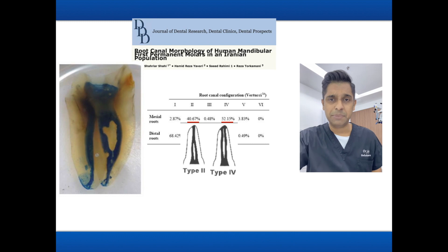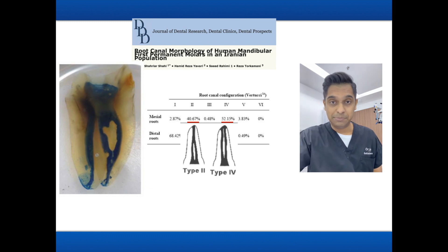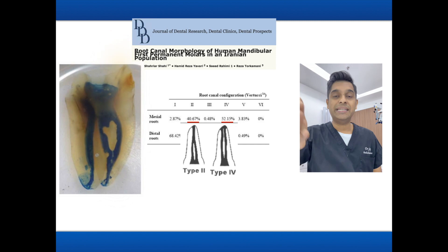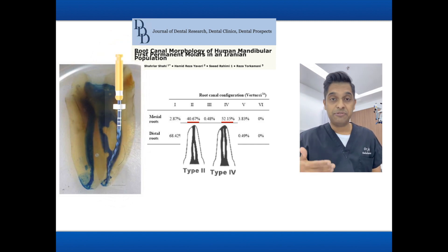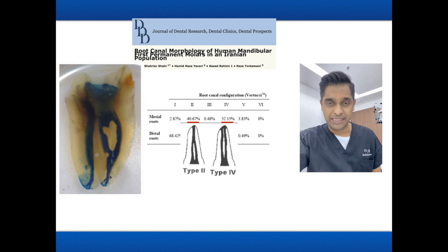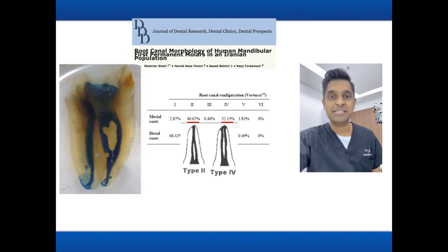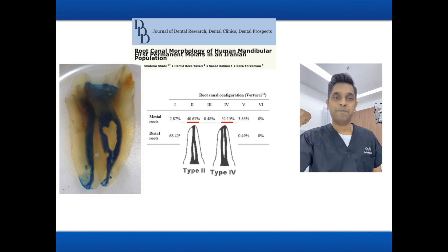When shaping the mesial buccal canal to the apex, the file takes multiple curvatures. If you're not careful in the initial stages, there is a real possibility of causing file separation due to cyclic fatigue.